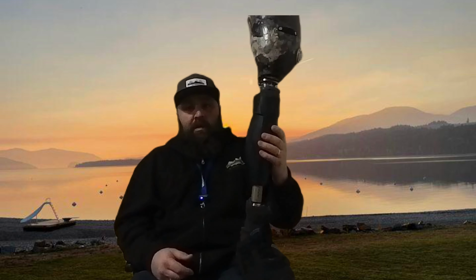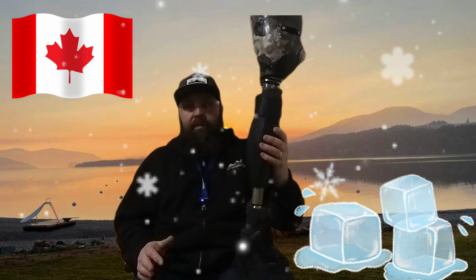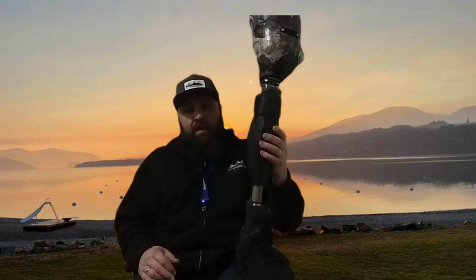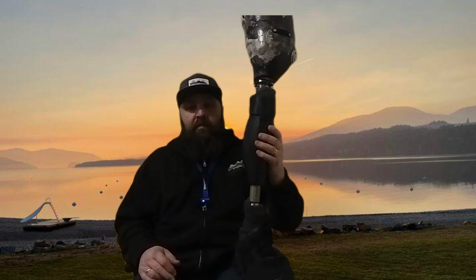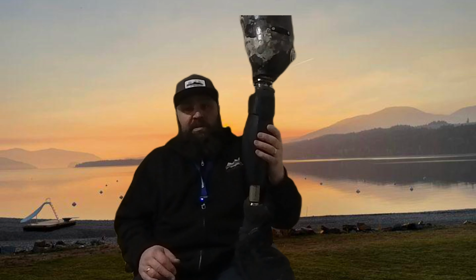So winter is the time that I use this the most. Here in Canada, we get lots of snow, lots of ice, and ice for amputees is a very, very tough thing because we can't correct our knees sliding on ice. So I'm like, oh no, what am I going to do? So they put in for funding, which I knew based off the history with WorkSafe that it would eventually get funding, but it's a big ticket item, so I knew it would take time.